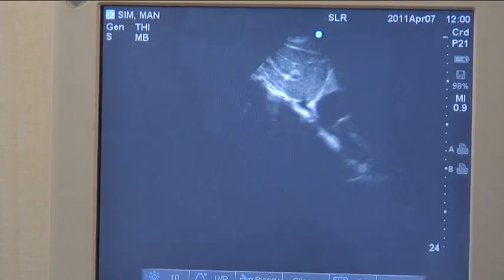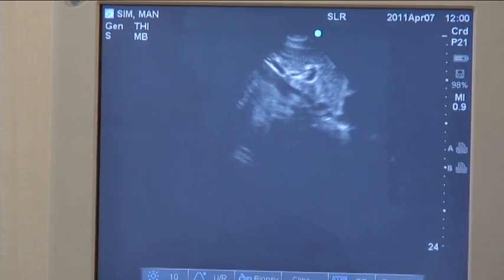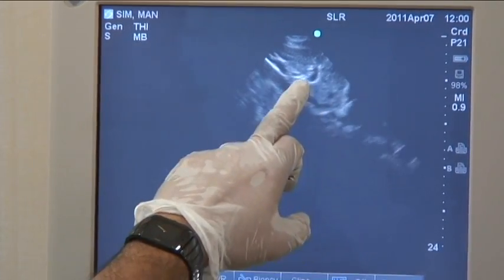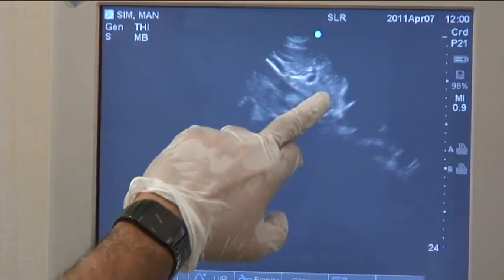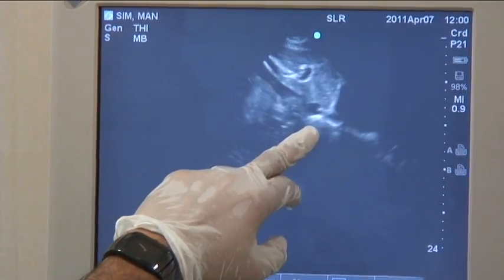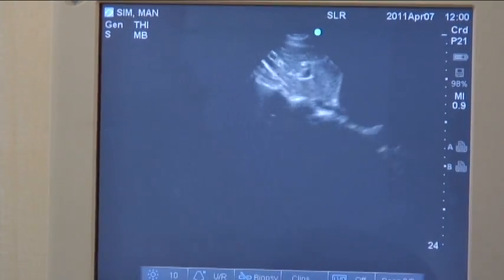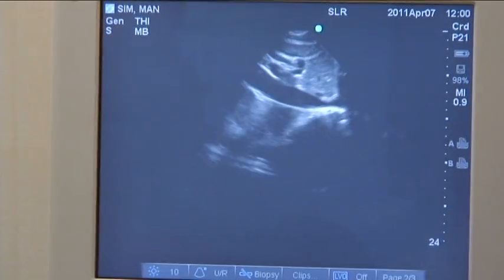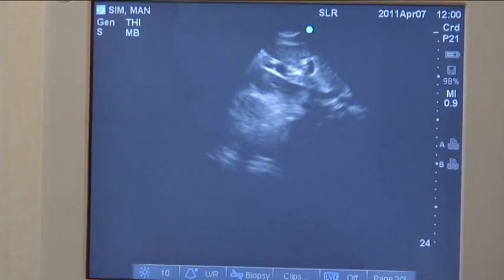Now, where you measure the IVC always comes into question. Generally, we like to measure it about 4 centimeters from the edge of the heart, the edge of the right atrium, or just distal to the hepatic vein. Now, you can barely visualize the hepatic vein here. Sometimes it's not visualized. So when you don't see the hepatic vein, you can use about 4 centimeters from the right atrial border. Let me just get a perfect view, and then I'll show you how to measure it. Okay, that pretty much is a good view.